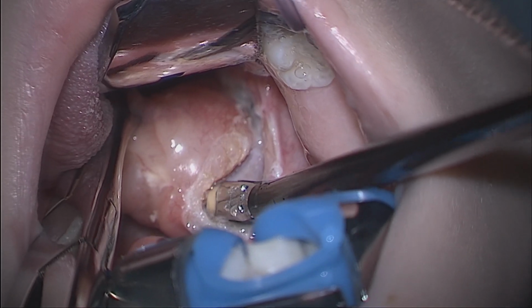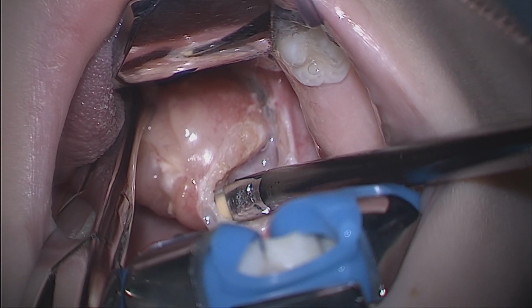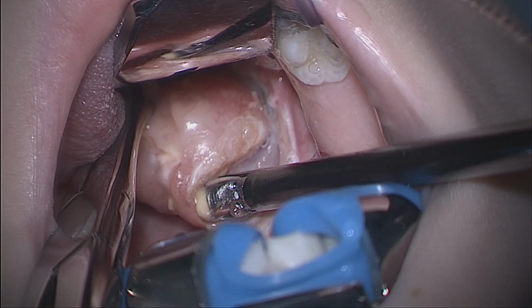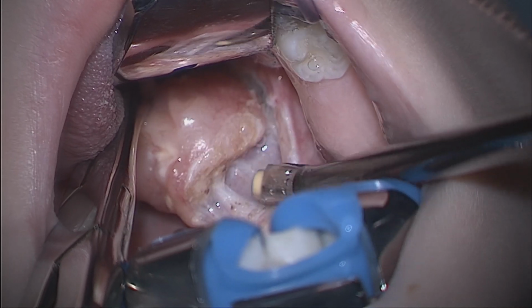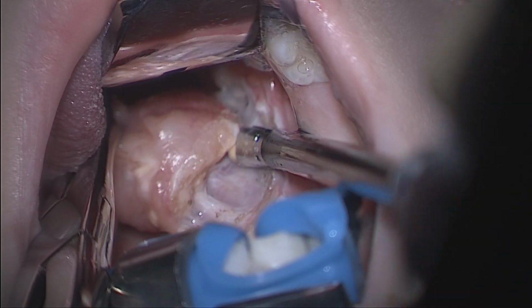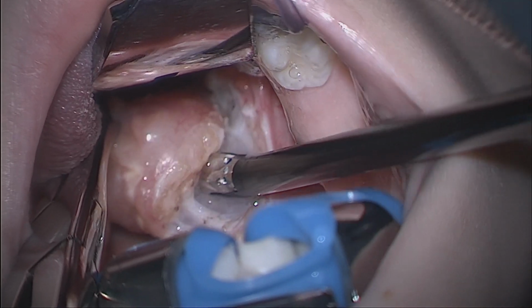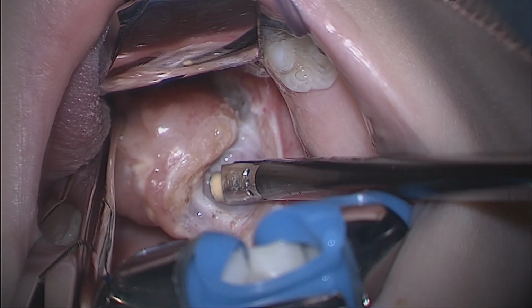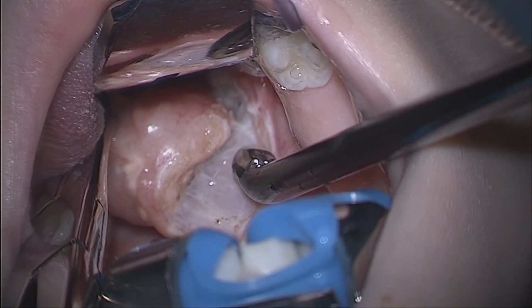I also prefer to use the operating microscope when performing this surgery. The improved magnification allows you to identify and cauterize blood vessels before they are dissected, reducing intraoperative blood loss. Secondly, the microscope is far more ergonomic than using a heavy headlight and/or loops, and allows the surgeon to remain in a head neutral position throughout the operation.